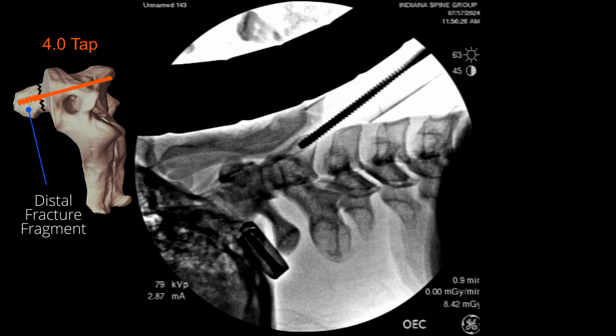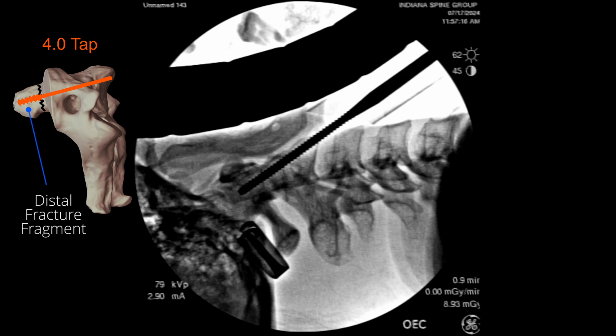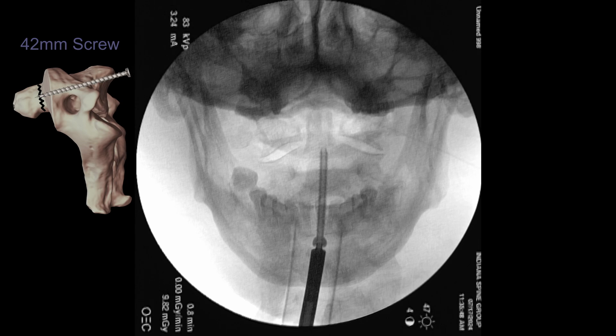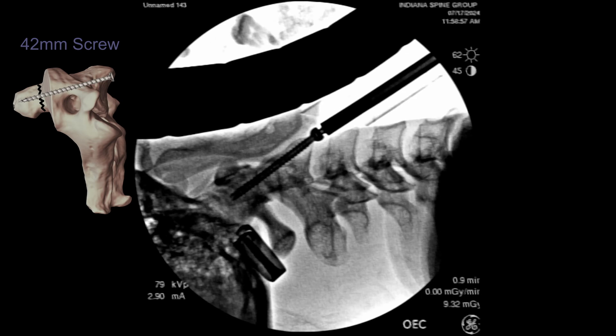The 4.0 tap slides right through the over-drilled section and then we tap the distal segment of the fracture fragment so we're not pushing it away as the fully threaded screw begins to engage. As we reach the far cortical surface of the dens, we can feel the tap begin to engage the cortical bone. We then place the fully threaded 4.0 screw, which slides through the over-drilled portion and begins lagging once it engages the distal fragment. The screw head sits nicely into the anterior lip of C2, and as the screw engages the cortical bone, the distal fragment is compressed, pulling the tip of the dens back into the C2 body.